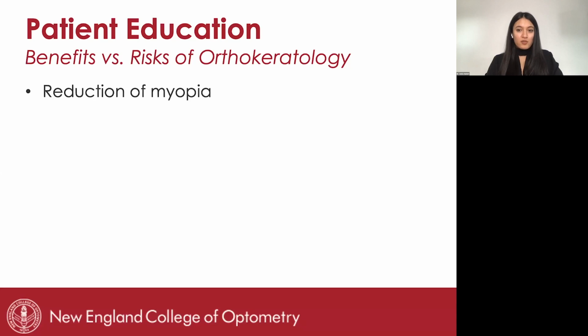A lot of times we have to make sure our patients know about this, so that they not only have that fear of making sure their lens is nice and clean every night that they're wearing them, but also are aware of all of the risks and benefits that come with Ortho-K lens wear. So the predicted amount of myopia reduction needs to be explained. We need to make sure the patient knows, especially if they're on the higher range of myopia.